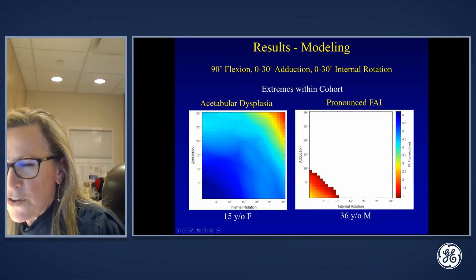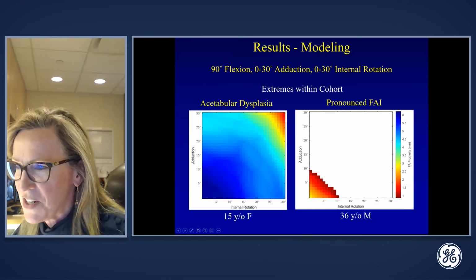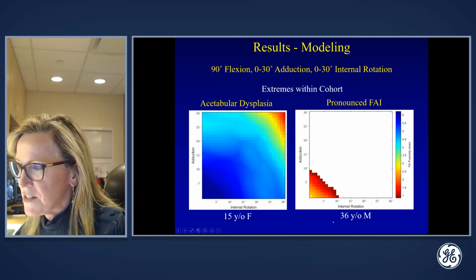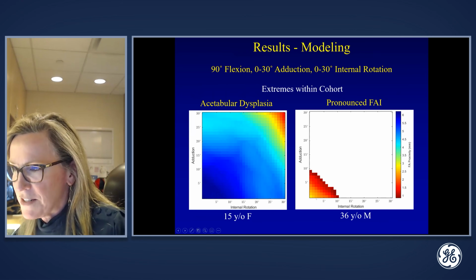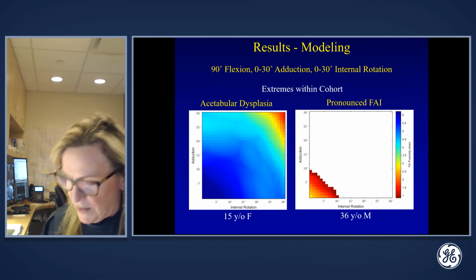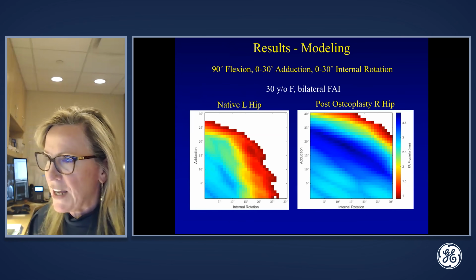So again, they have a huge range of motion, or can tend to be unstable, if you will. So you can see how this great degree of motion occurs. This is again proximity, whereas in the patient with femoroacetabular impingement, there is restricted range of motion. So we don't see that much increase as we increase adduction and internal rotation.